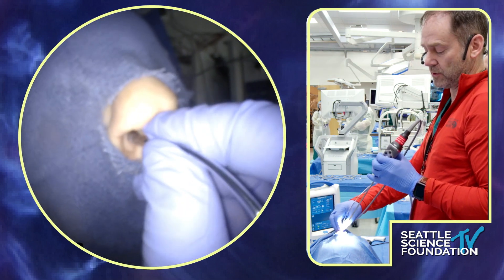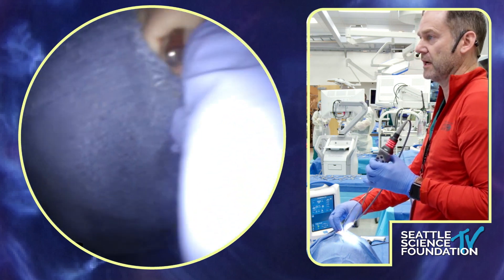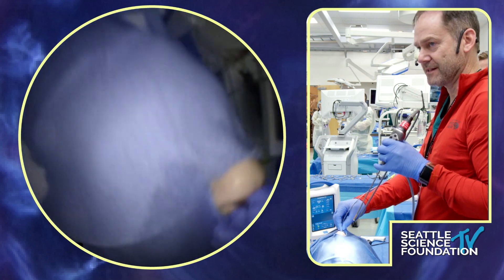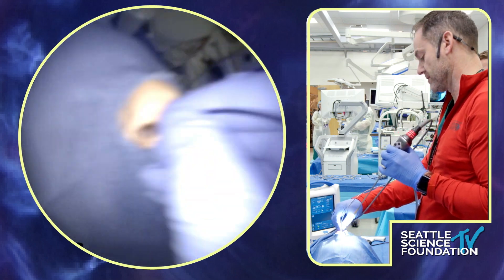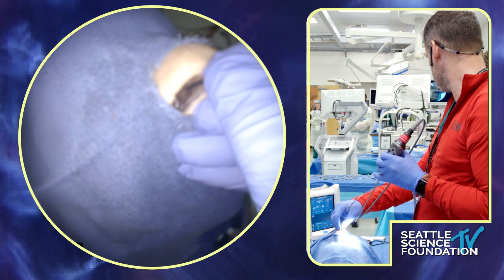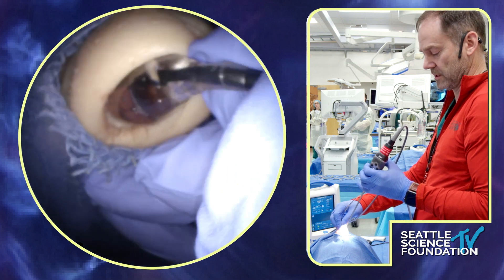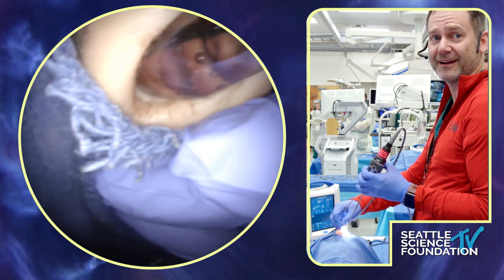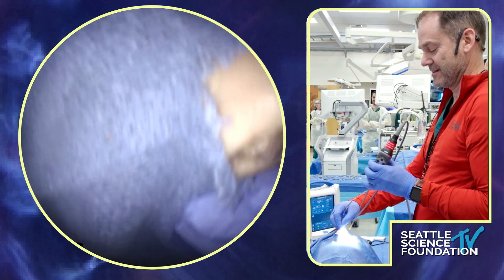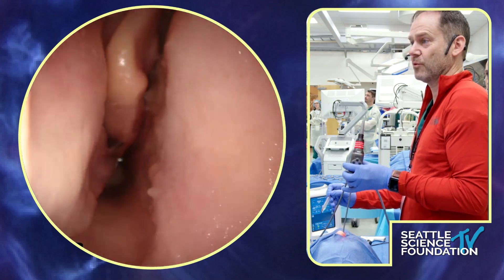When you inflate the balloon over a spur, you have a chance of popping it, so sharp spurs aren't the best case for this. You also have to exert a fair amount of pressure with your hand to keep pushing it into the nose, otherwise it's going to pop out. Go ahead Connor. You can see how it starts to distort the nostril — the patient's doing okay. All right, deflate. Let's see how it looks.